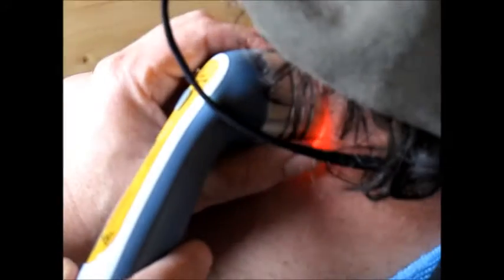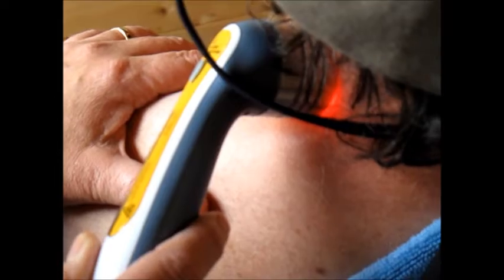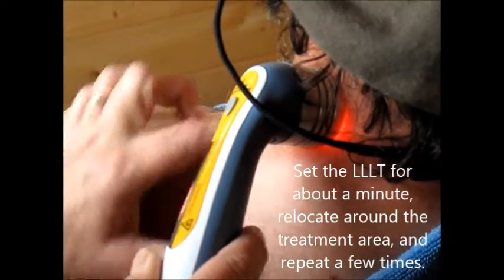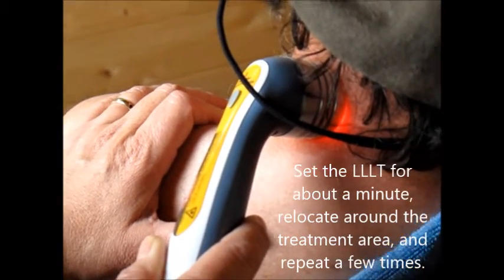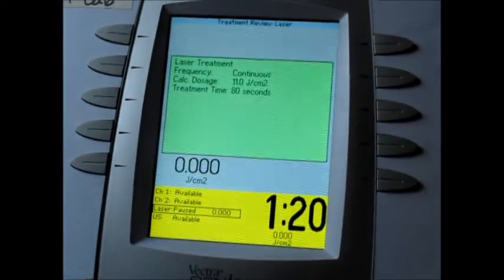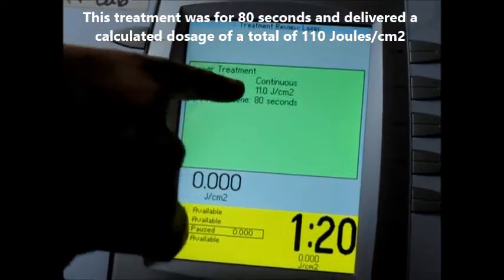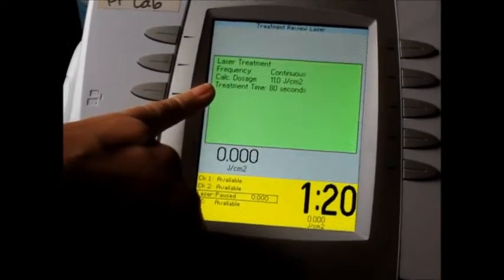So far this has been counting down — we've got about 16 seconds to go. It's a pretty fast treatment. I usually go for about three to four minutes, in increments of one minute, moving around the area where the problem is. At the end of all the treatments, I like that you can actually see what the dosage was that was delivered and what the treatment time was. You can put this in the patient's records.